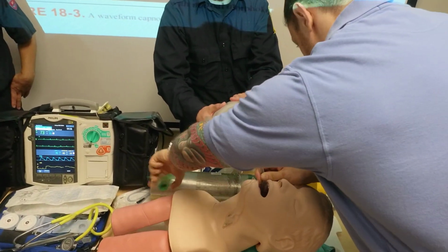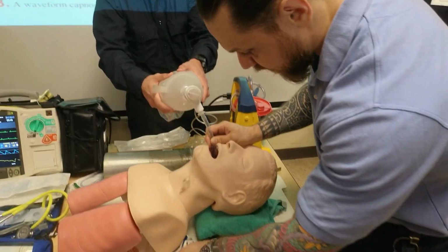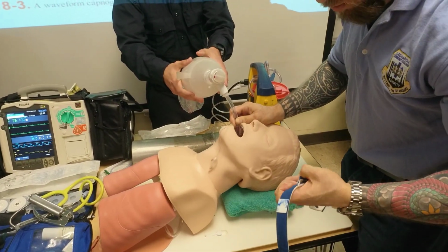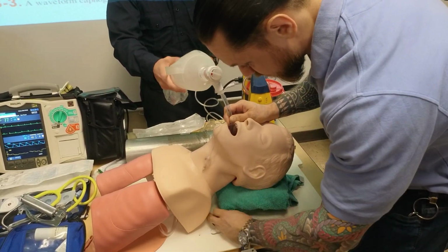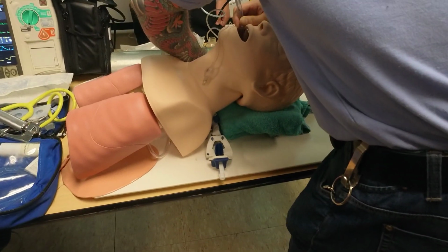Yes. Right. So now what we're gonna do, this is called a Thomas tube holder. We're gonna secure our device in place, right? What is it called? Thomas tube holder. And I'm gonna show you, there's a few important things about it. This is a commercial holder. You could use tape, but for here, we're gonna use this device.